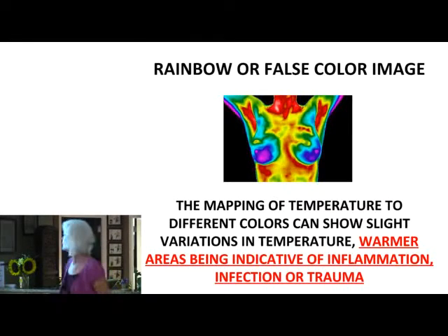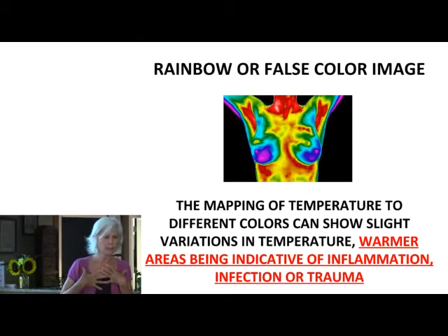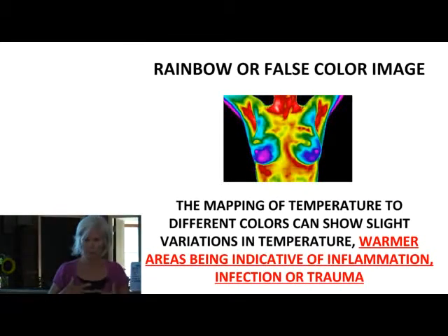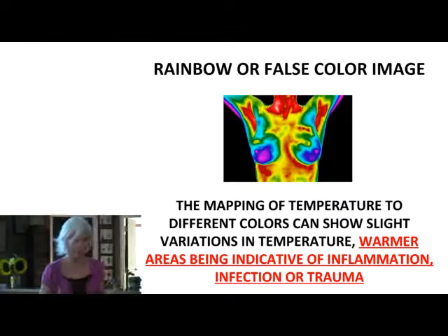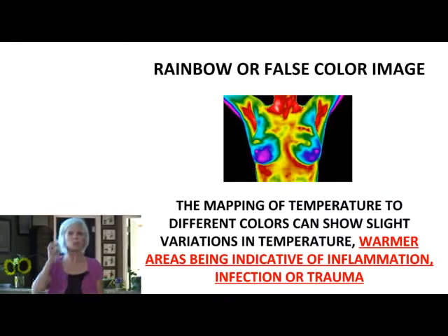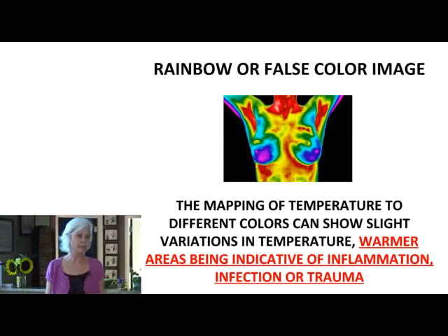Why image heat? Because if we find significant heat, it can be one of three things. It's trauma, you had an accident, and maybe the airbag inflated and you got hurt. That doesn't happen often, but it could. Infection: mastitis is infection, but you can have an infection of the breast and not have mastitis. And if it's not one of those, then it's inflammation.